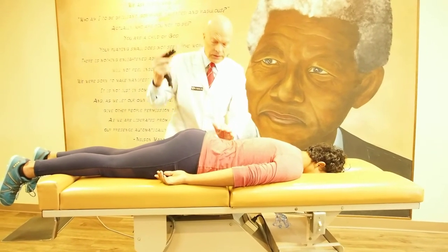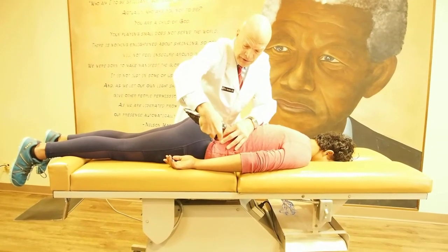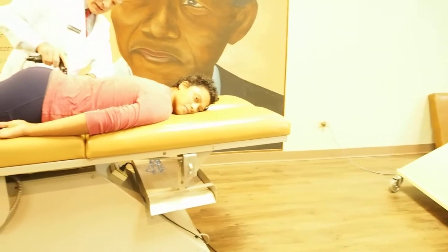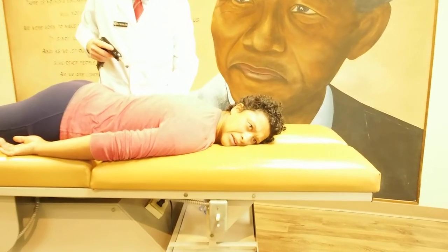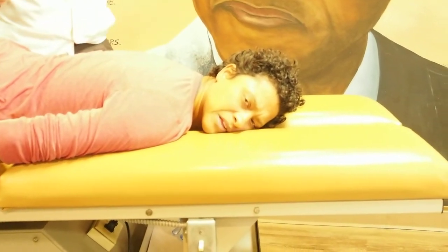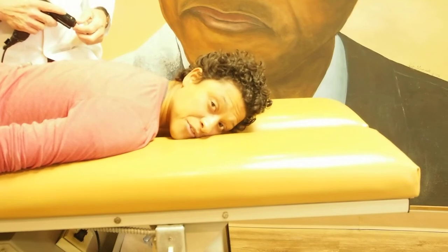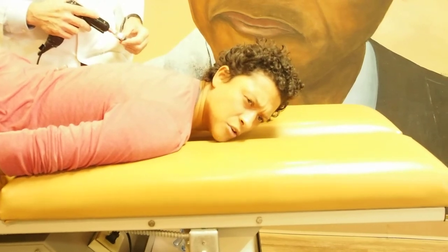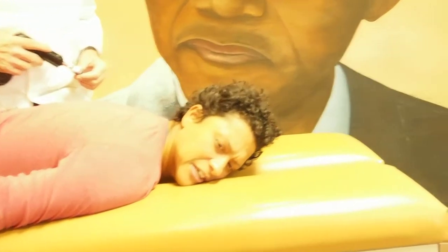I can also work on the muscles with the instrument. I'm feeling trigger points here in her pelvis too, because she works very hard. People wonder: does chiropractic hurt? She says she really likes this advanced tool — it allows her to be very relaxed and receptive to the adjustments, unlike traditional methods where you may be unsure about the pressure. She finds it very targeted and it doesn't hurt at all.